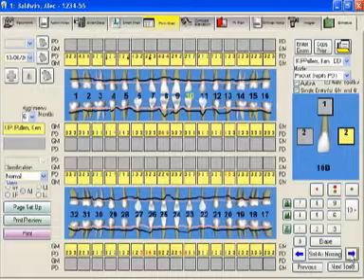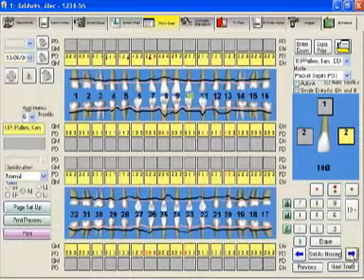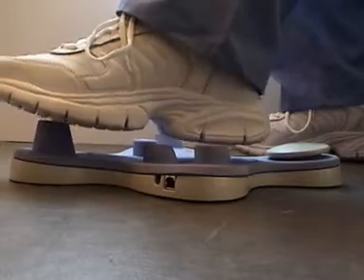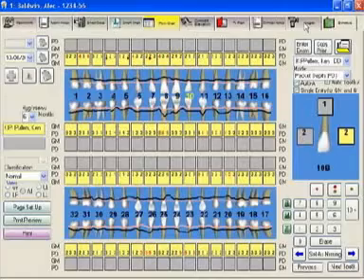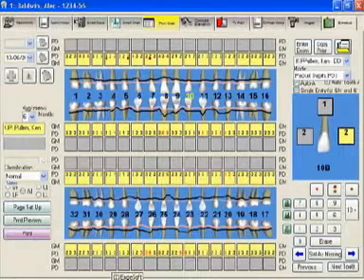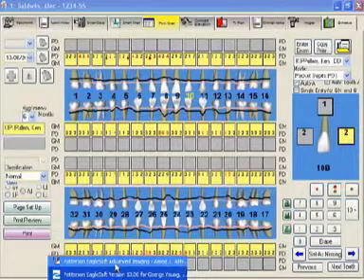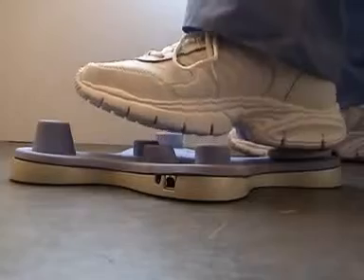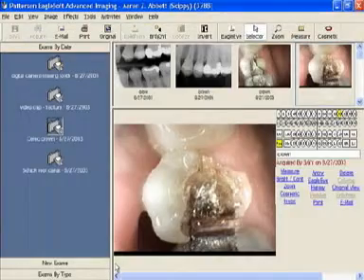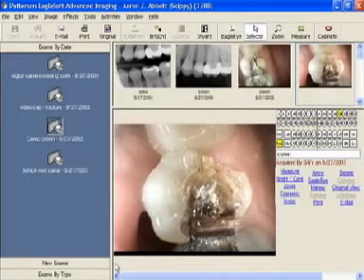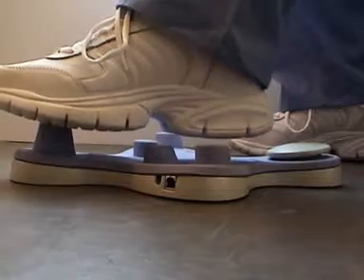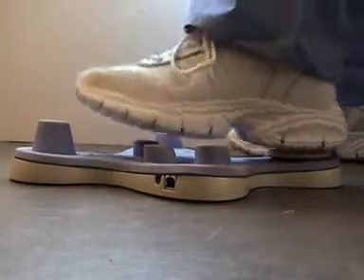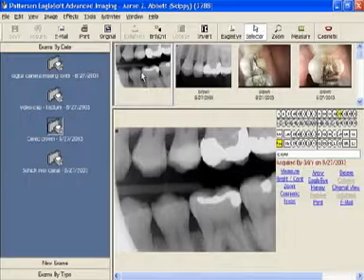Since it is a mouse, you can do everything with it. You can run your x-rays. If you have your x-rays in the complete exam, you would just mouse up to your images up here and you would heel click on those and it would bring up your x-rays there. I don't. I just have the Schick x-rays down at the bottom. So I minimize my x-rays and then I would just heel click and bring those up. But it makes it so handy when you're using your x-rays and your intraoral camera. You can just mouse right up to whatever you want to look at with your toe and then heel click and it will bring that open.